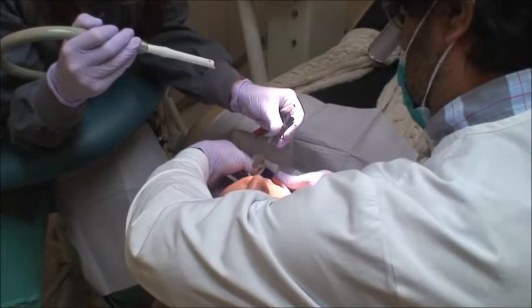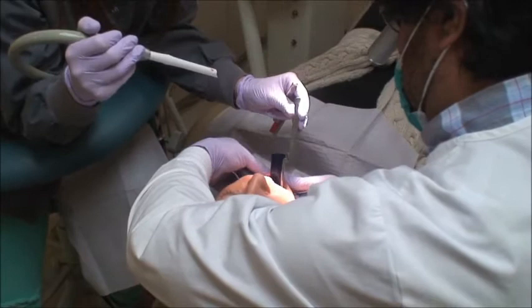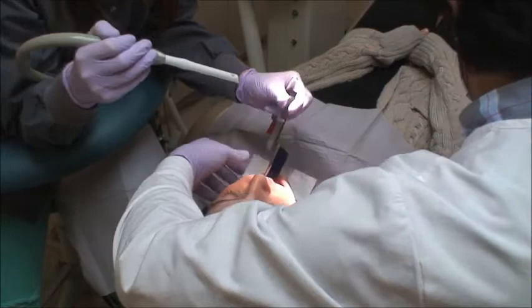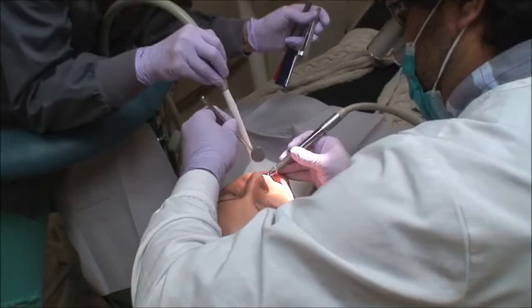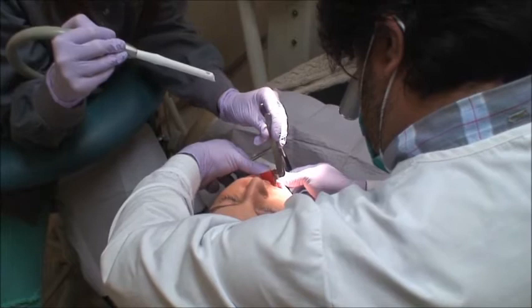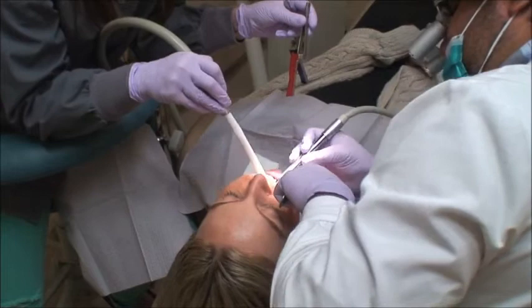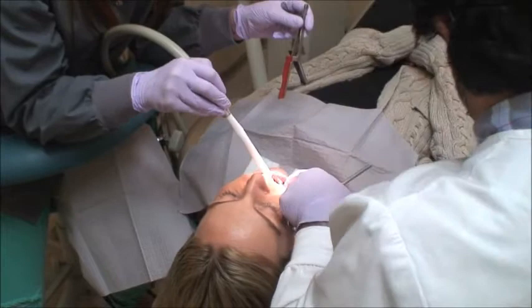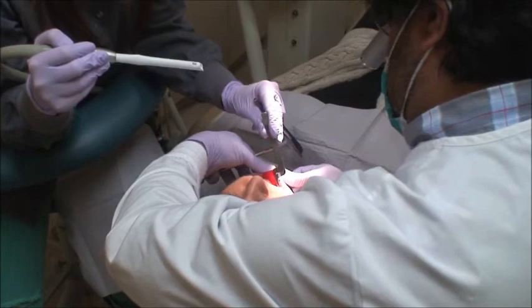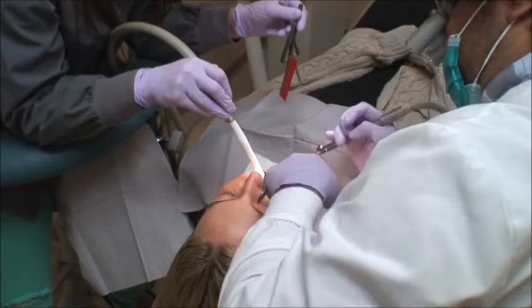After finishing my centrics — the last adjustment on the centric stops — I move on to laterals and protrusive. As you can see, the assistant switches to the red articulating paper on my command. I first position the patient in centric, then ask the patient to slide the mandible right and left. I position in CR, check right and left again — any red marks outside of the blue I will adjust. No water during this process. The assistant is not suctioning water; they're suctioning saliva using the high-volume evacuator. That is basically the technique.